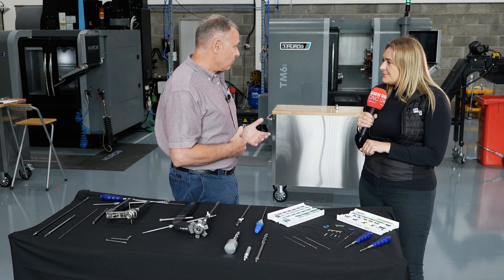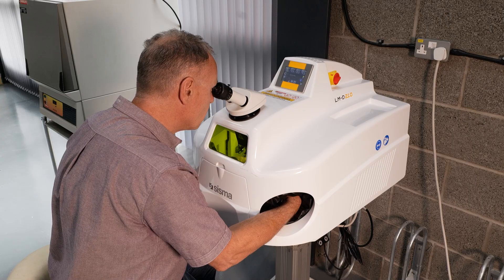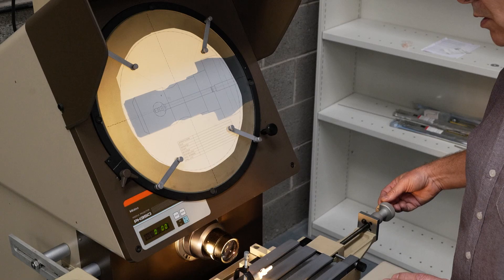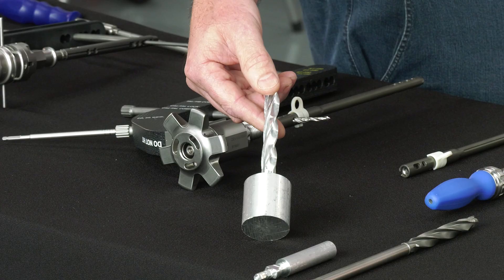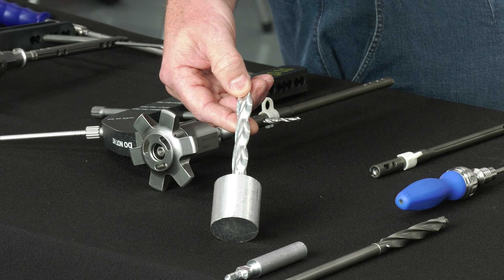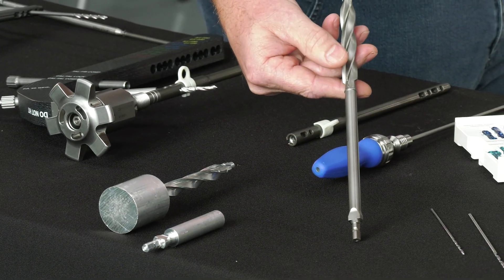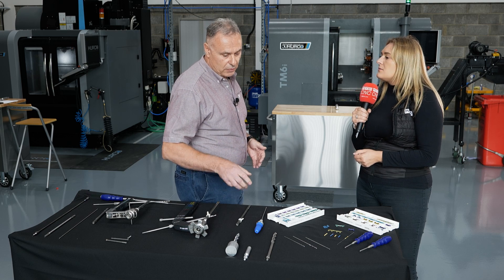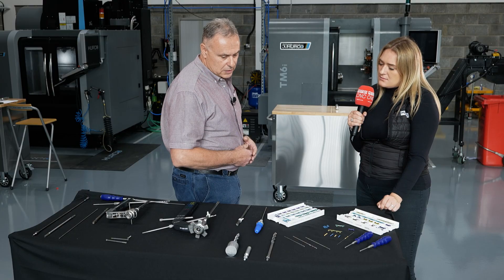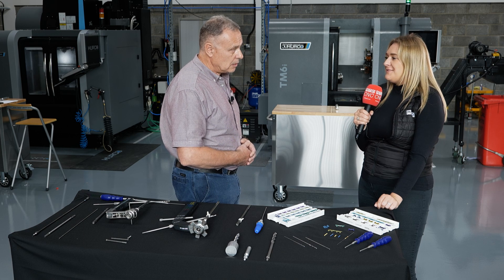How long have these machines been in here? It's relatively new — this place has been open only two months, and already we've started making our own instrumentation. For instance, this is a reamer that we needed to make for cadaveric testing — this is the aluminium billet and this is the finished product. How long did it take to make? If we'd sent it out to a subcontractor we could have been looking at 16 weeks — we actually did it in four days. From machining to finishing, four days. That's huge — absolutely huge.